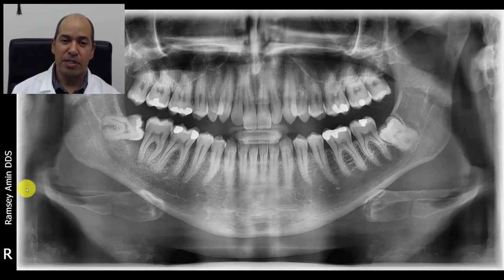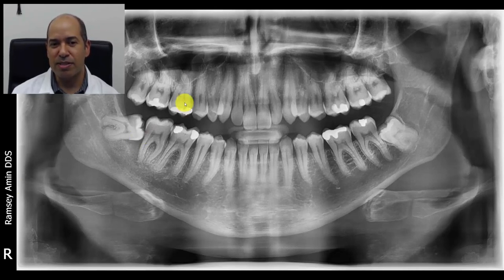There's a lot of what I call misinformation out there about implant length and size. Bigger is not always better — by no means is that the case — but there is a normal size for teeth. You can see the upper molars have multiple roots, and front teeth have less roots because there's less pressure. Notice they're all long. The upper jaw looks black and more hollow on panoramic x-ray, while the lower jaw looks more white and dense. Bone that is softer needs more support, more length, more diameter whenever possible, because there's not as much surface area.